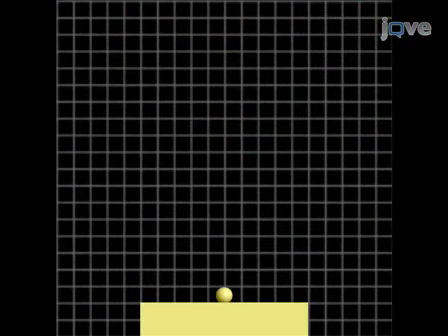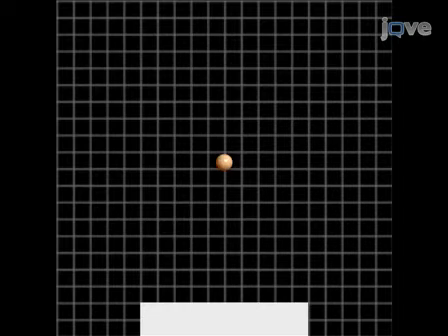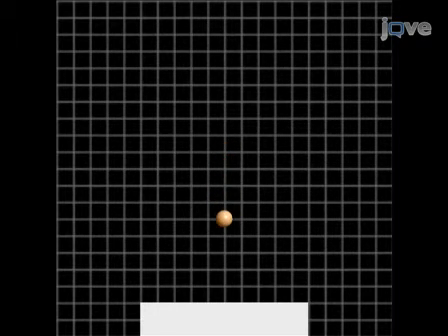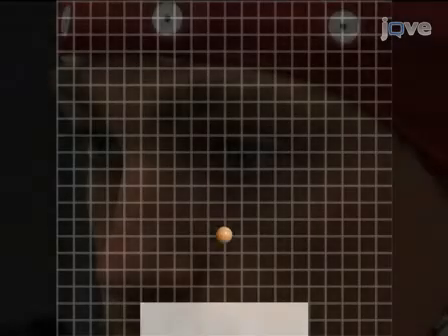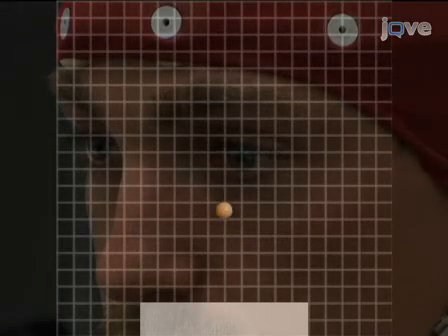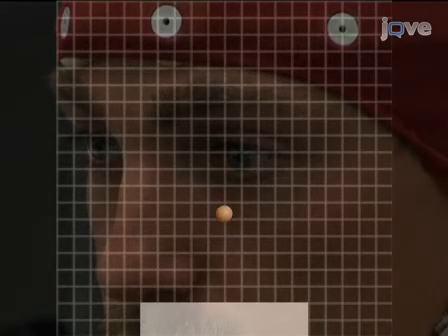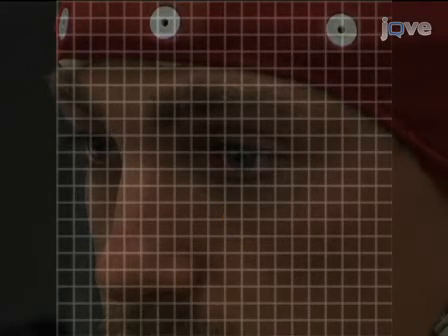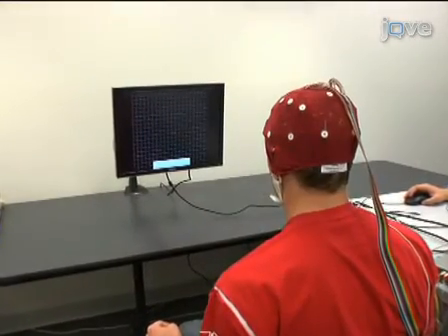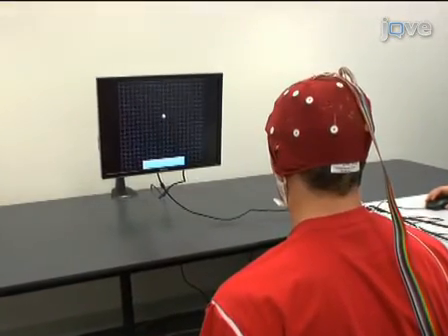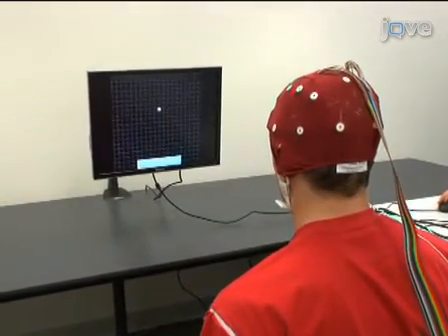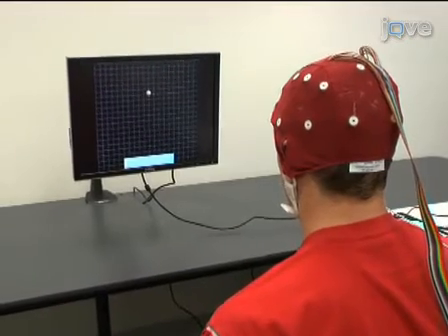If the subject hits the target, it changes colour. After five seconds without a hit, the session times out and is counted as a miss. After the trial, there is a two-second intertrial interval during which the subject can relax, blink, swallow or otherwise readjust positions.